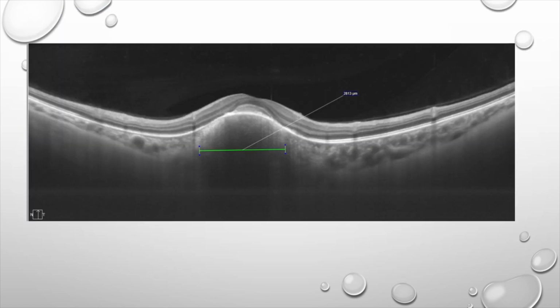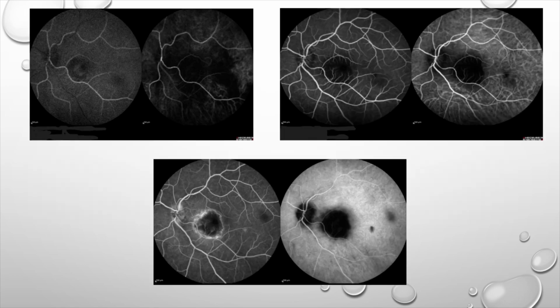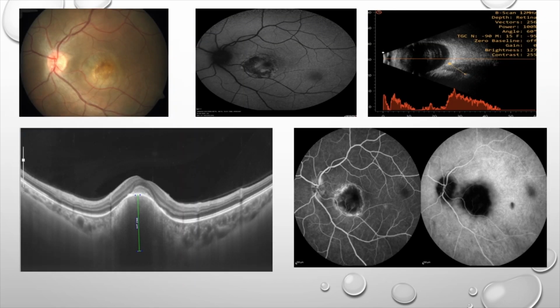So the reason why this was just shown is because it is just an approximate value, not the true way of estimating this. Not only tumor thickness goes into monitoring the lesions, we also have other parameters, and these parameters are going to be evolving, because as we know, in the beginning the mnemonic was small, now the mnemonic is getting bigger and bigger. So I'm sure Ovis is going to tell what the mnemonic is and how we use that. Yeah, you have to describe the mnemonic now.